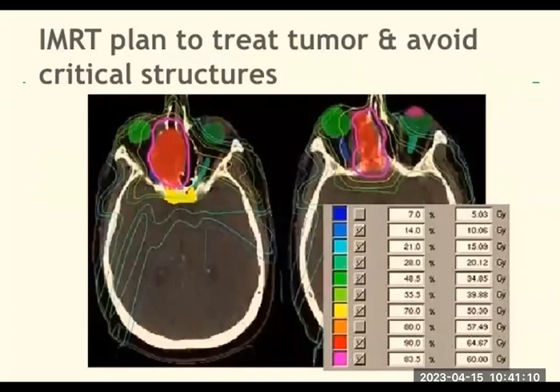The radiation beam pattern is divided based on whether we are going for an inverse planning or a forward planning method. In the inverse planning method, the dose is fixed and only the intensity is modulated. In forward planning, the intensity is given step by step in an iterative way, and finally we decide the dosage.